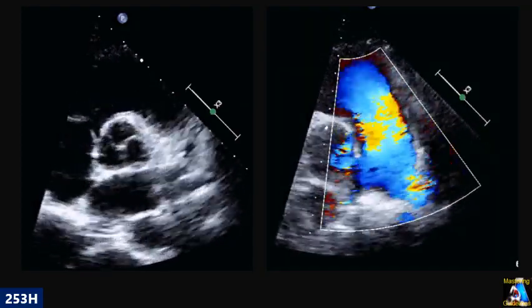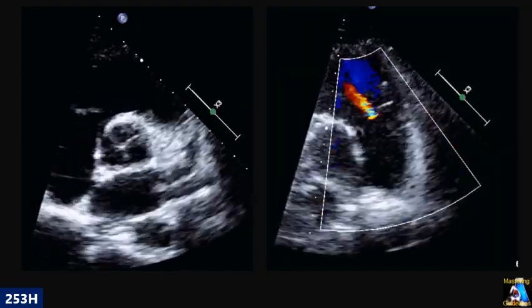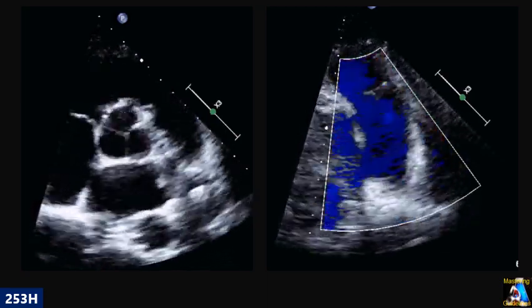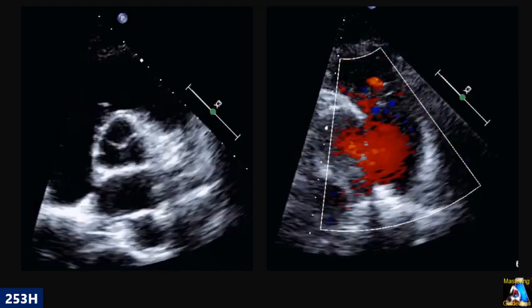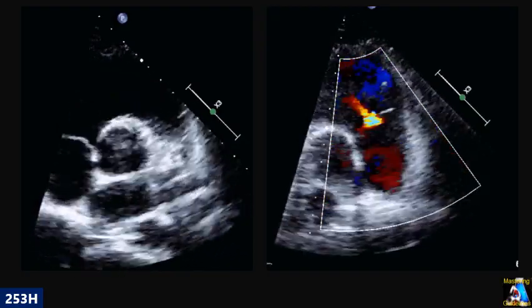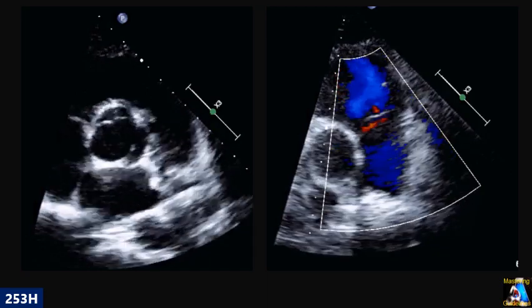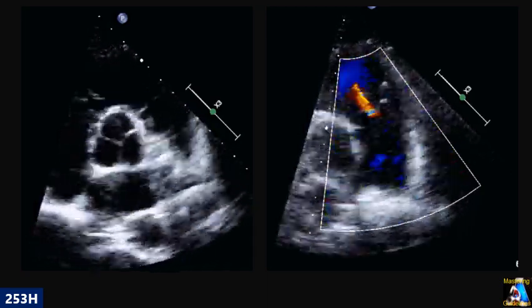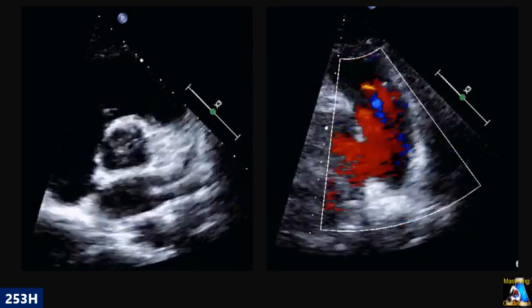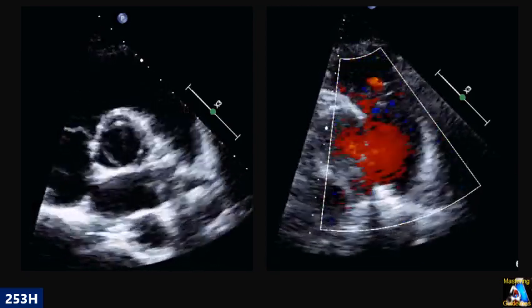Here we have another. You are getting the PSAX at the aortic valve. Now you want to see the pulmonary bifurcation. What maneuver did the tech do to get this view? Just one maneuver or two maneuvers, depending. Many parameters and landmarks.